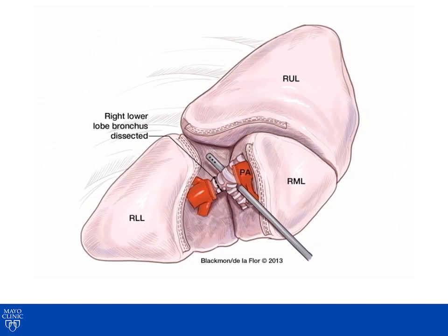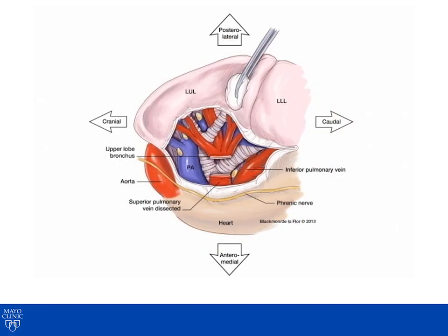inferior approach. When performing a video-assisted thoracoscopic left upper lobectomy, you use the same technique as the illustrated port approach and also perform the posterior pleural dissection first. Once the posterior pleural dissection has been performed, you can then retract the lung posteriorly, approaching the lung from the front to the back as you divide the hilar structures.